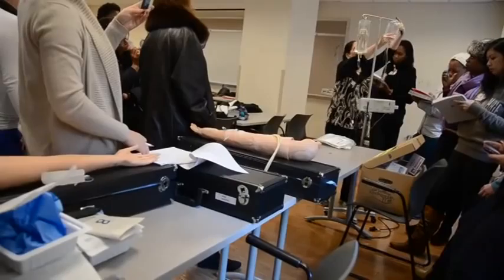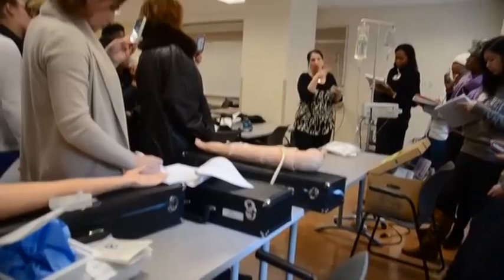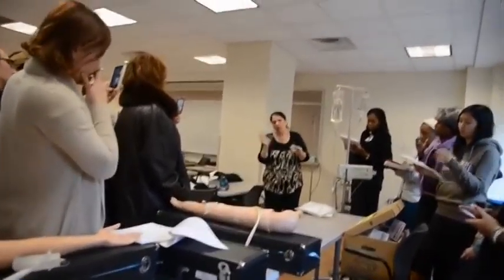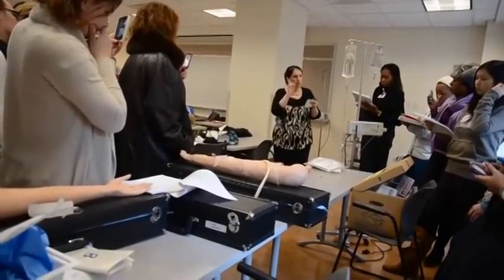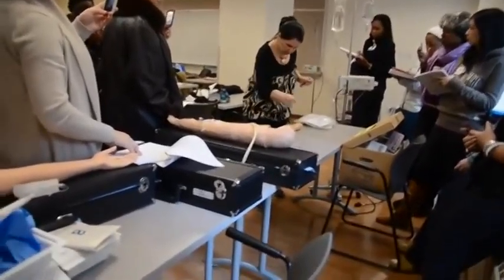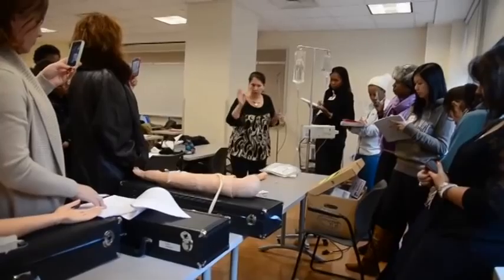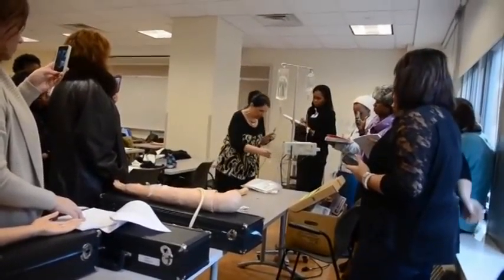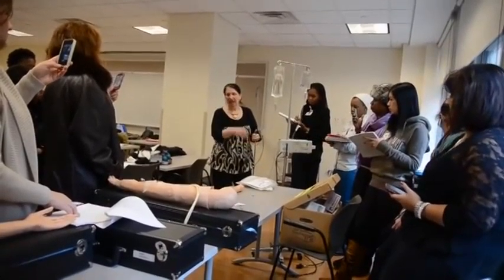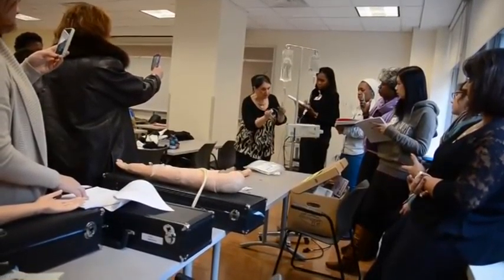We'll tell you what's in it — faculty make up different things. We're using 50 and 100cc bags. I put my label on. Now I have to figure out what I'm doing. I already checked it, assessed the site, ID'd the patient, told the patient what I was doing. So where am I going to put this now? This is pump tubing, so we're going to have a regular IV that's not going to be on a pump.